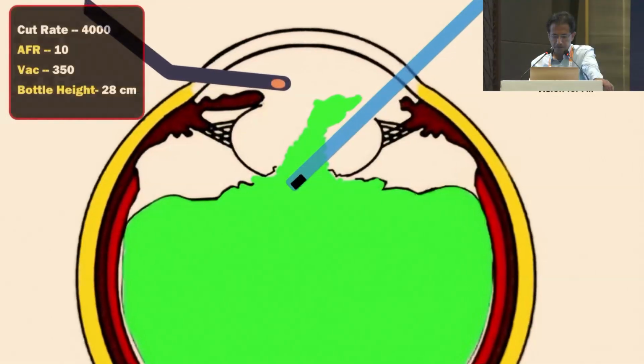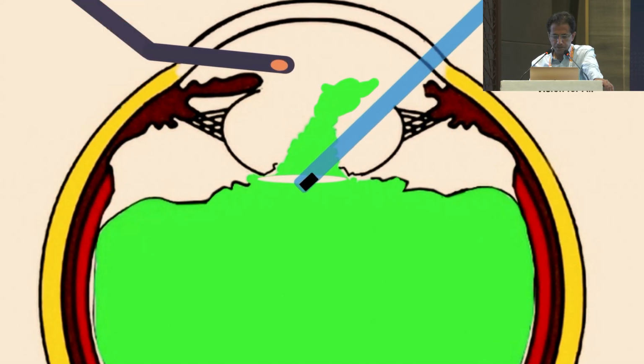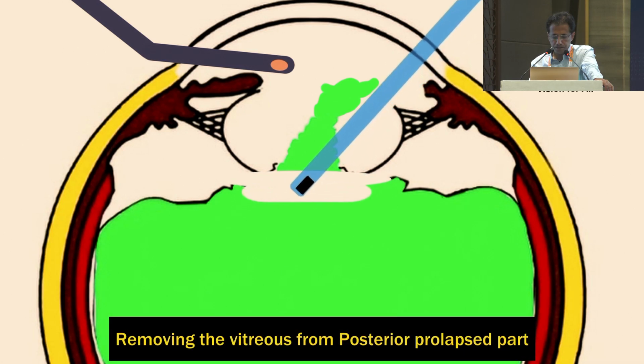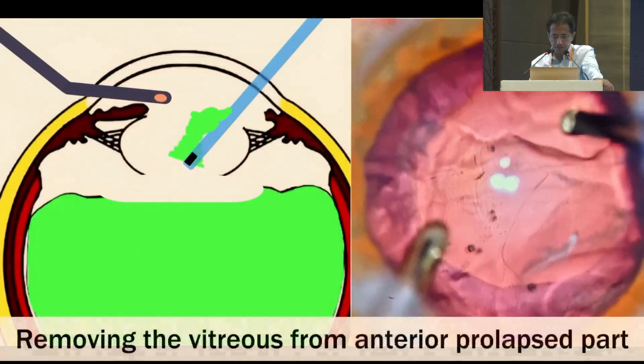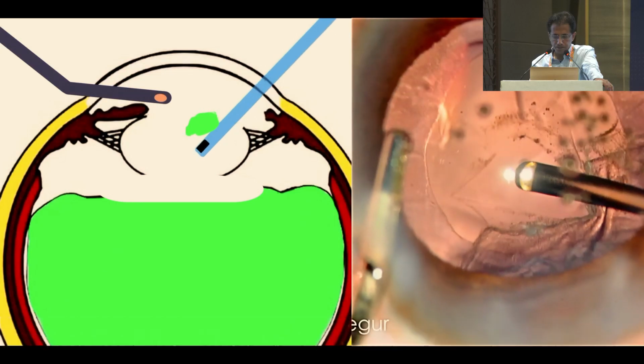And finally, segmenting the vitreous in two parts by placing the cutter behind the posterior capsular tear helps us to cut the vitreous around and behind the PC tear, and at the same time lose the communication with the prolapsed anterior vitreous. Dealing then with the anterior prolapsed vitreous is not going to enlarge the posterior capsular tear.